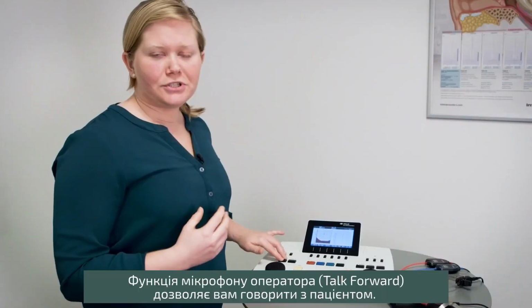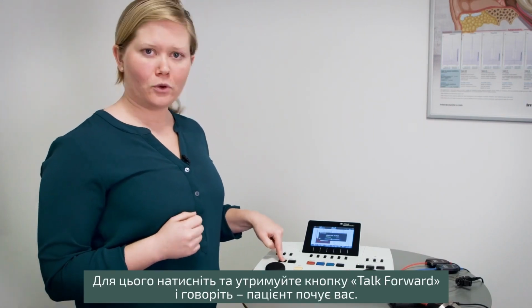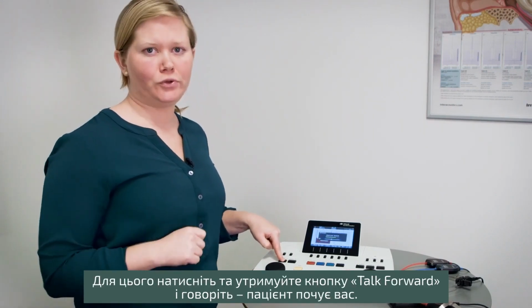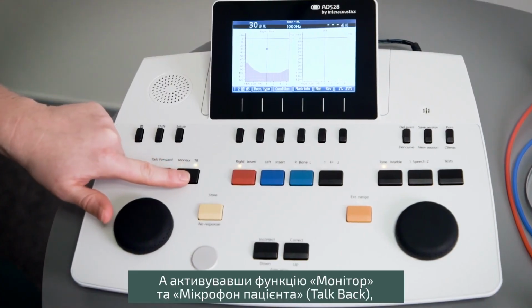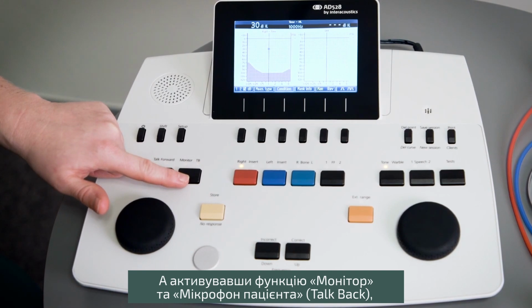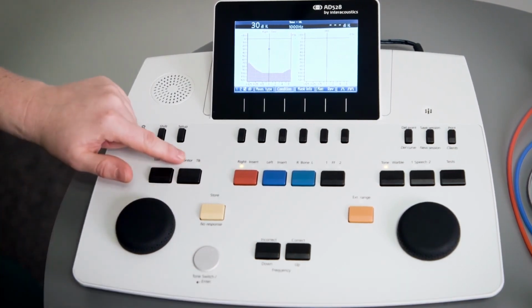The talk forward function allows you to talk to your patient by holding down the talk forward key so the patient can hear what you are saying, while you can enable the monitor function and the talk back to hear what is present in the channels and what the patient is saying to you.